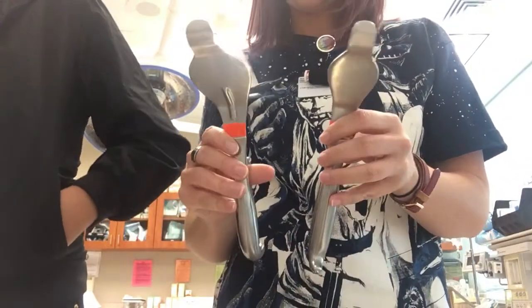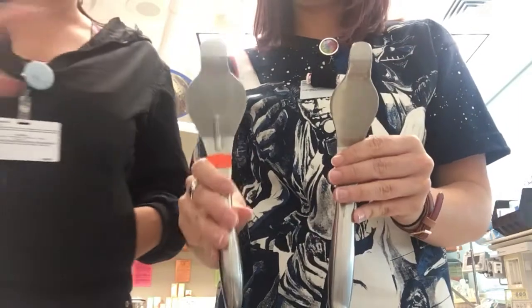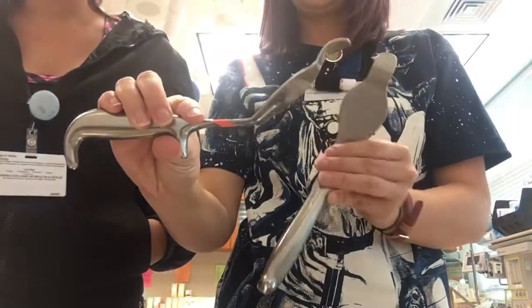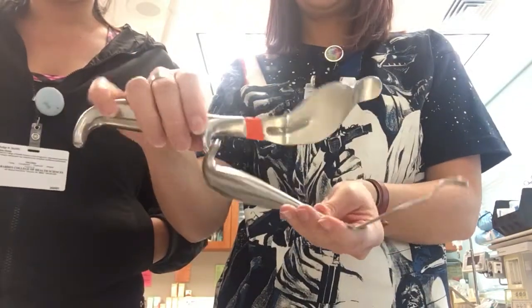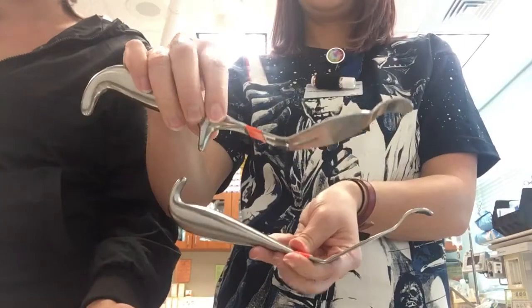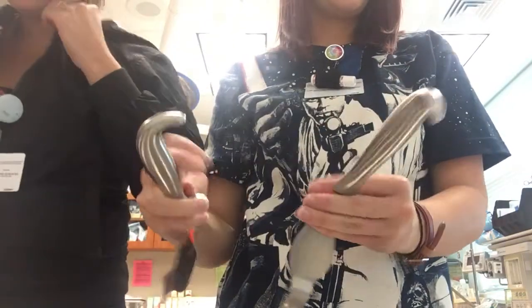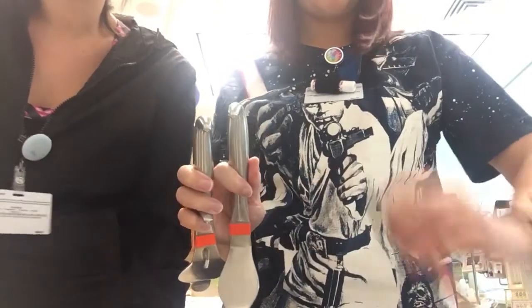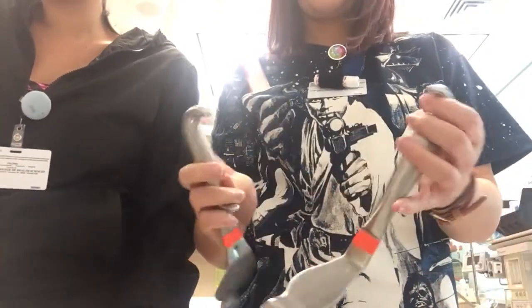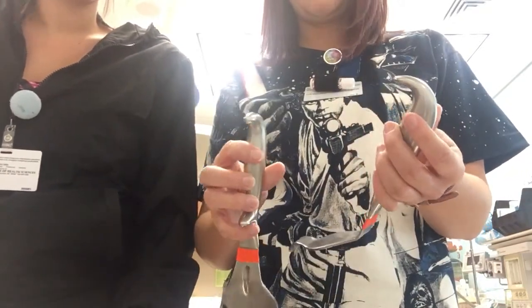These are Bennett retractors. This is the large — see the large? And this is the small. The large is obviously bigger and it also has this extra little piece at the bottom. There are some other instruments that have that bottom similar to this. I kind of feel like this looks like a little Smurf hat, and if it was a Smurf his name is Bennett.